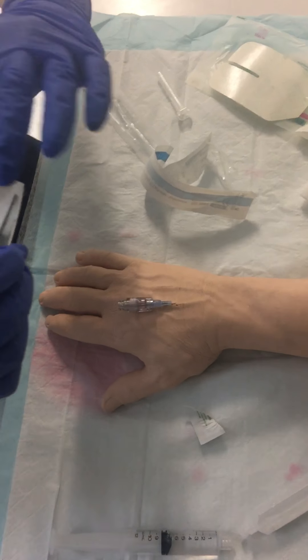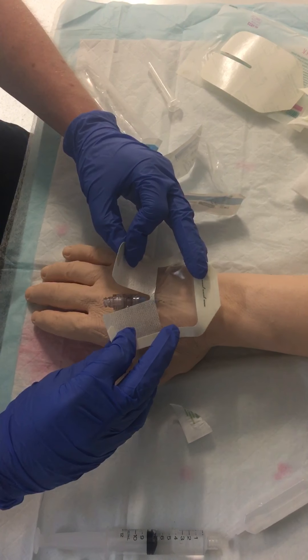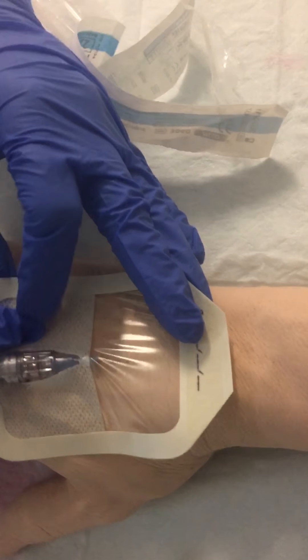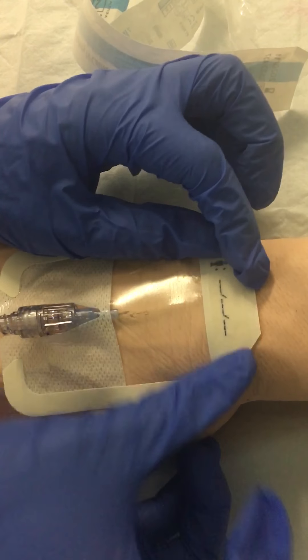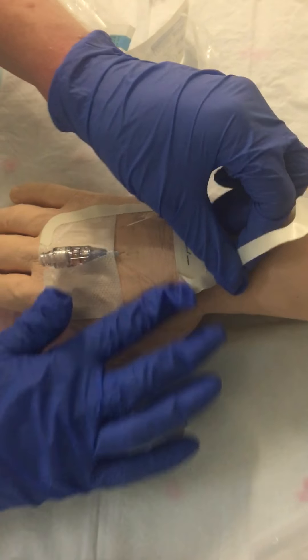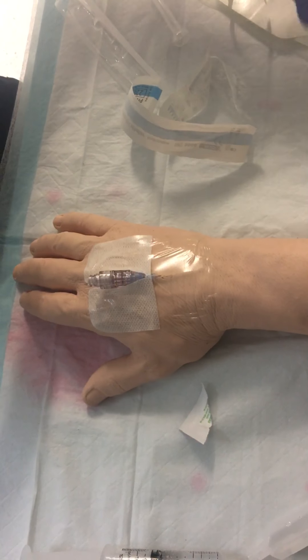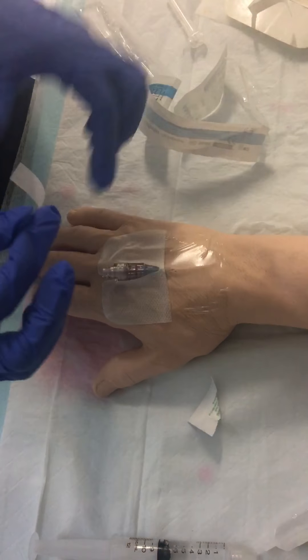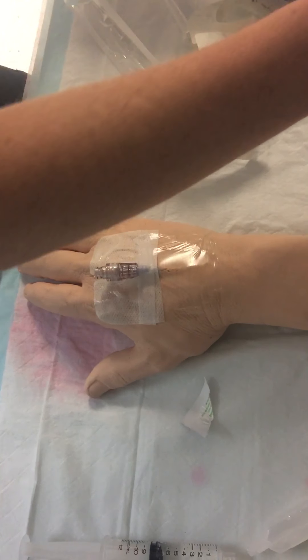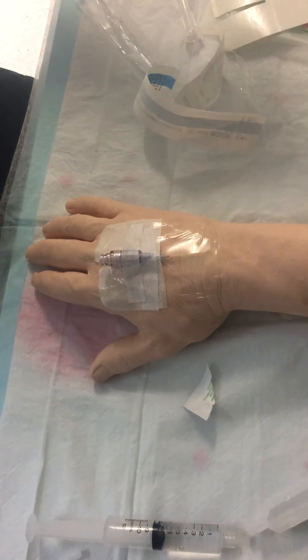The next step is to secure it down. I'm going to take the tegaderm and hold it like so — you want to place it so you can still see the top of the cannula hub. Place it down securely. Then peel this part off, making sure it's nice and secure. Then place strips of tape to make sure it's nice and firm.